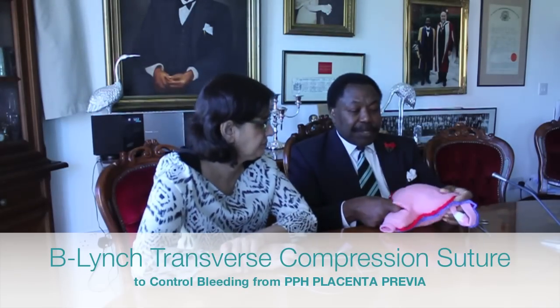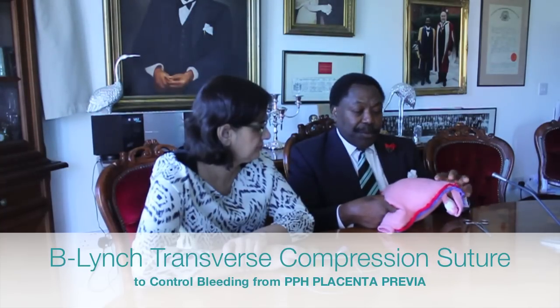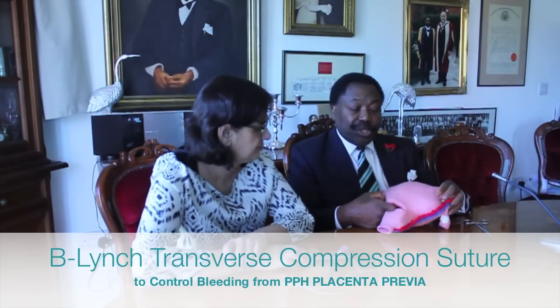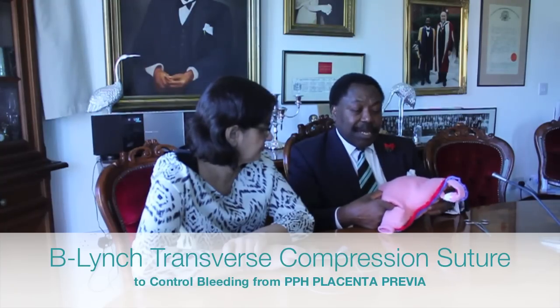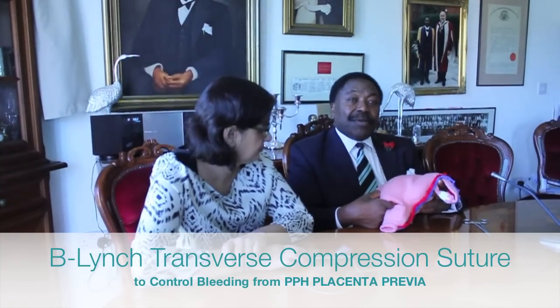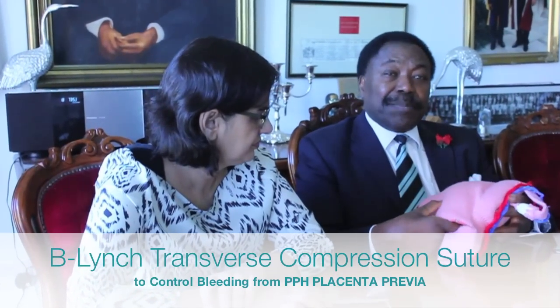The purpose of this video is to describe by demonstration the correct way to apply the transverse compression suture to control bleeding from postpartum hemorrhagic placenta previa.